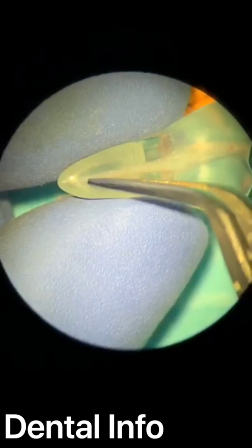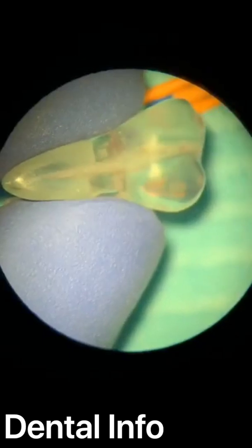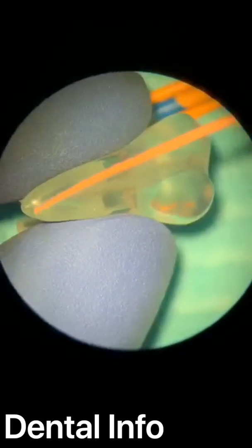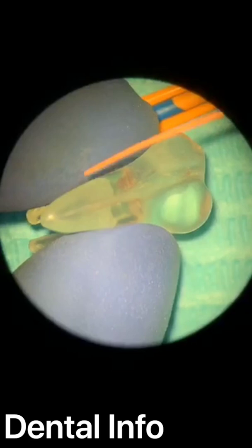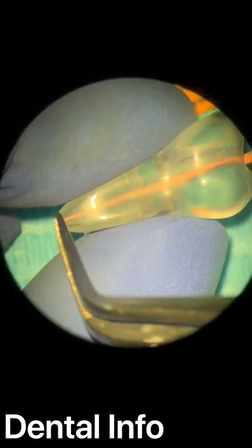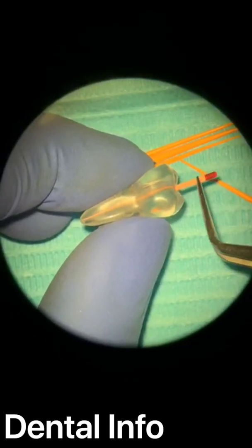And we will now make a live demonstration explaining that. I told you I have different gutta percha cones here: 2504, 3004, 35, 40, and I have taper 6 too, and I will show you what happens here. I have the 2504 gutta percha cone now. I will insert it in the canal and take an X-ray. So here it's good. I can't push it more. That's the maximum, but I don't have good tugback here. I don't have tugback at all.